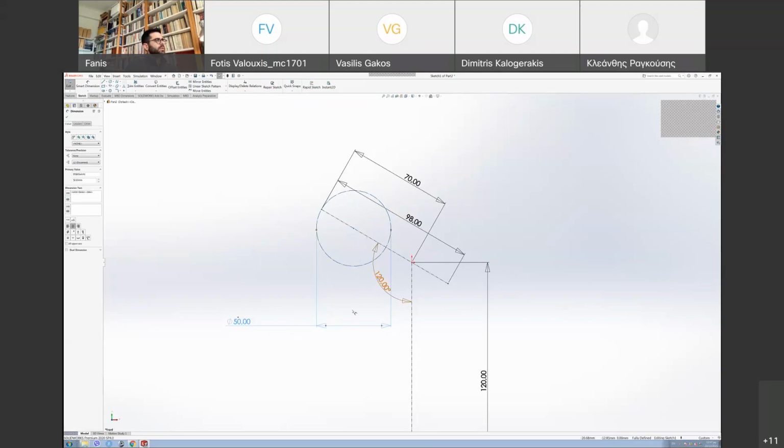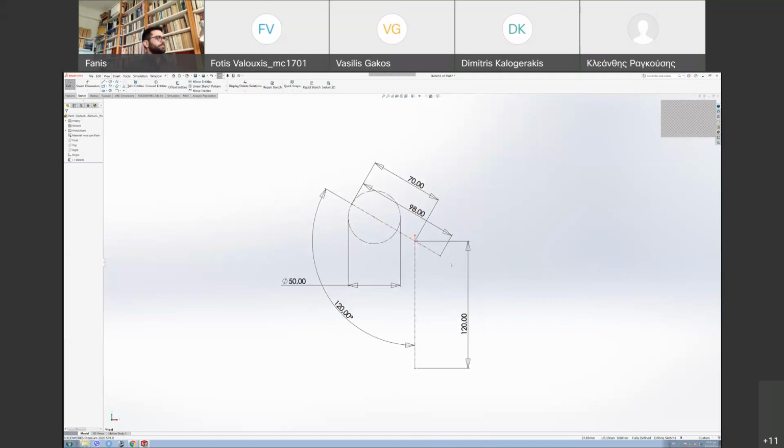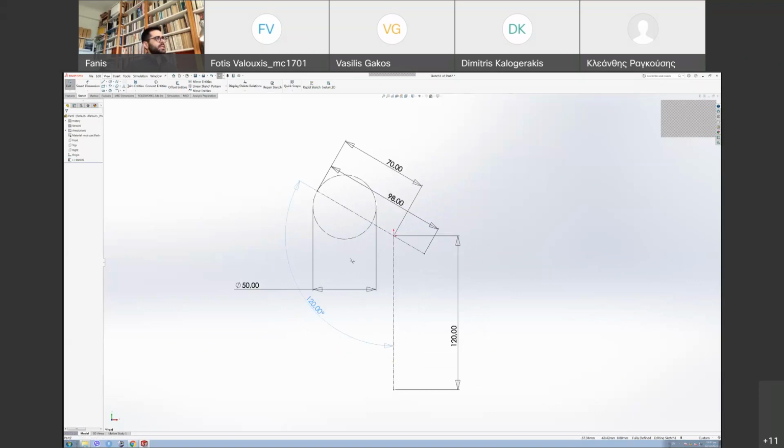So, okay, one thing to know, you probably know it, but for me it was useful. When you see everything black in SolidWorks, that means your entire sketch is fully defined. Okay, and you can't move anything. So that's helpful because sometimes things can move around in sketches if you haven't defined them, and this can be really tricky. So we have this very basic sketch. You see these are the critical geometries, dimensions rather, we got from our 3D model. So we'll start working on this sketch and try to create a 3D model out of it.